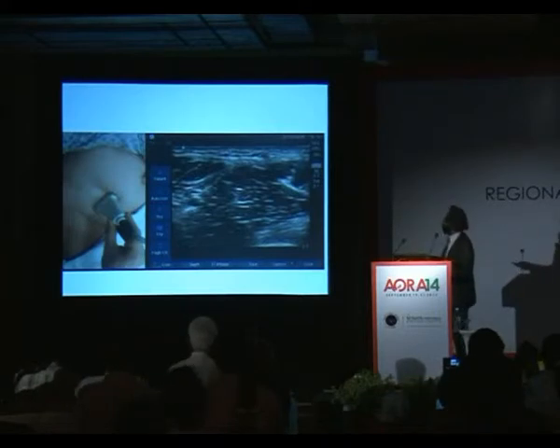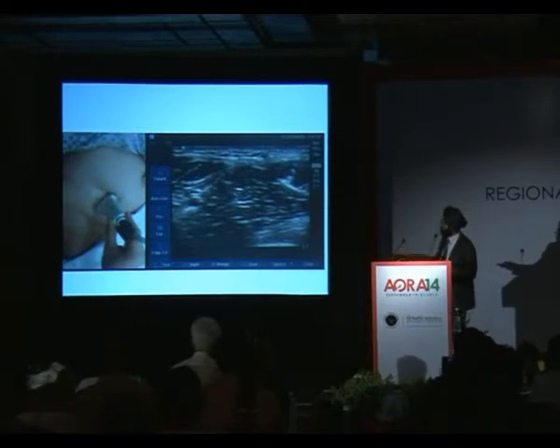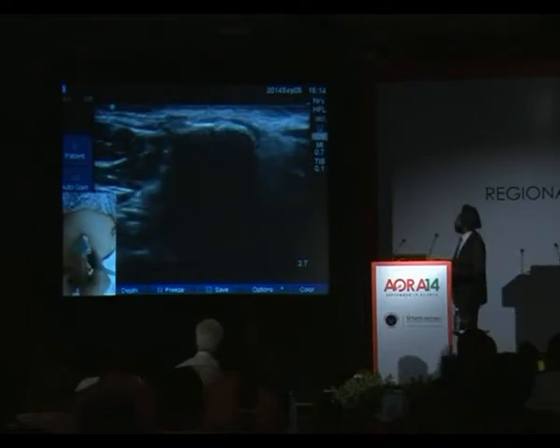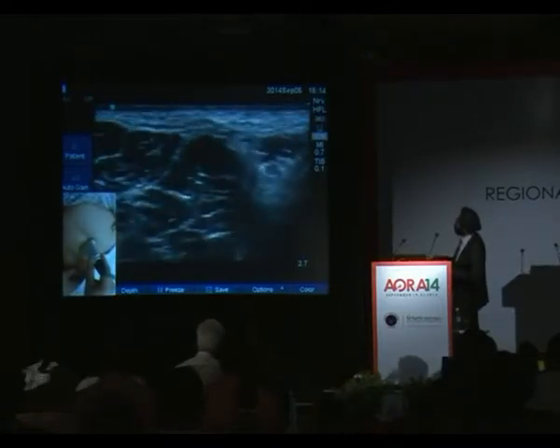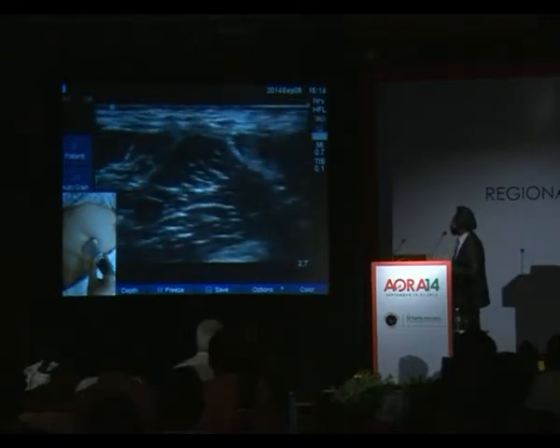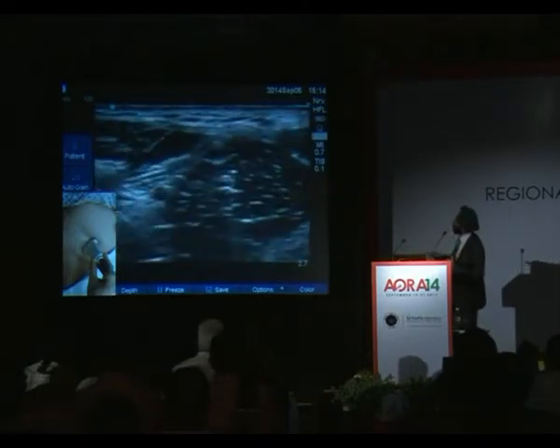And this is our end point, when we can recognize this hourglass pattern with the two muscles that we have discussed, sartorius and internal oblique, and our iliacus down there. So what I'm going to do next is run these two slides together. We'll start from the anterior superior iliac spine. I'm going to move the probe down. This is the kind of picture you get. And you move your probe just about an inch and a half till you get to this pattern. You might need a bit of lateral and medial angulation to make the fascia and the underlying iliacus more prominent.